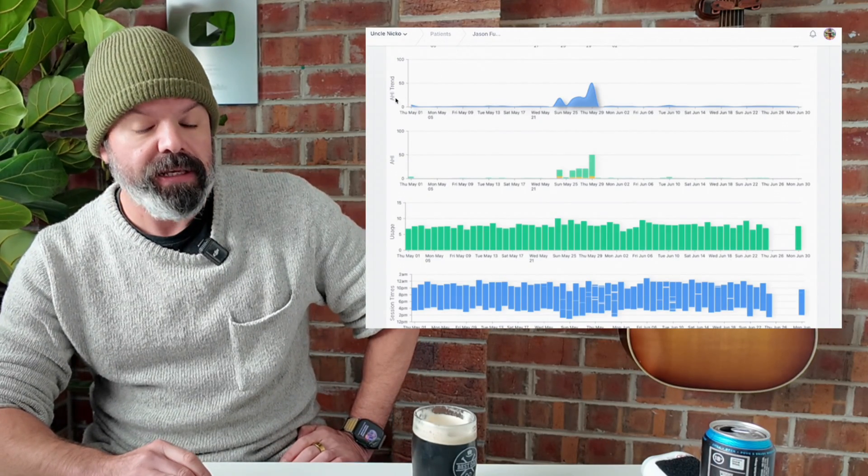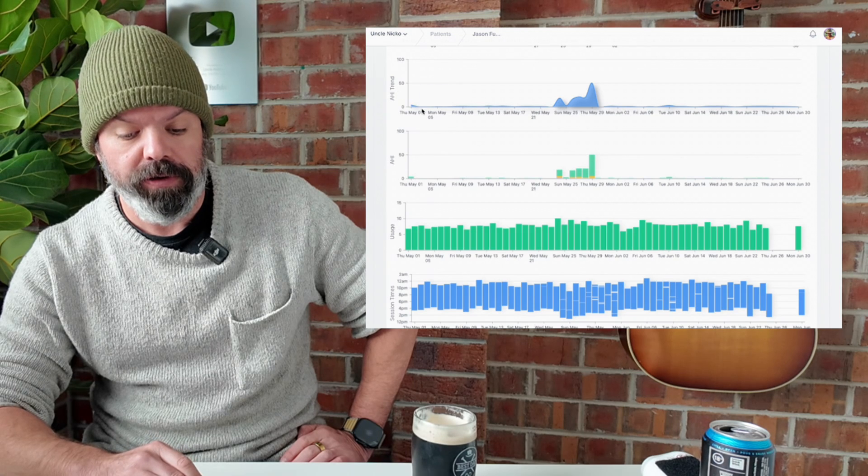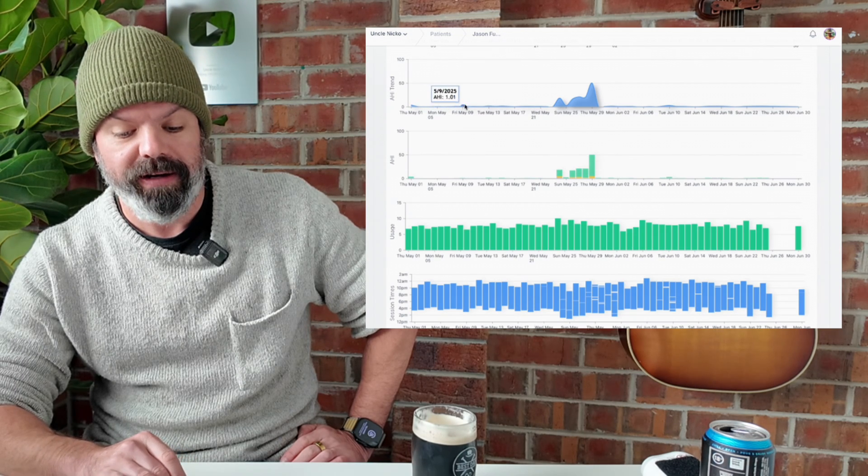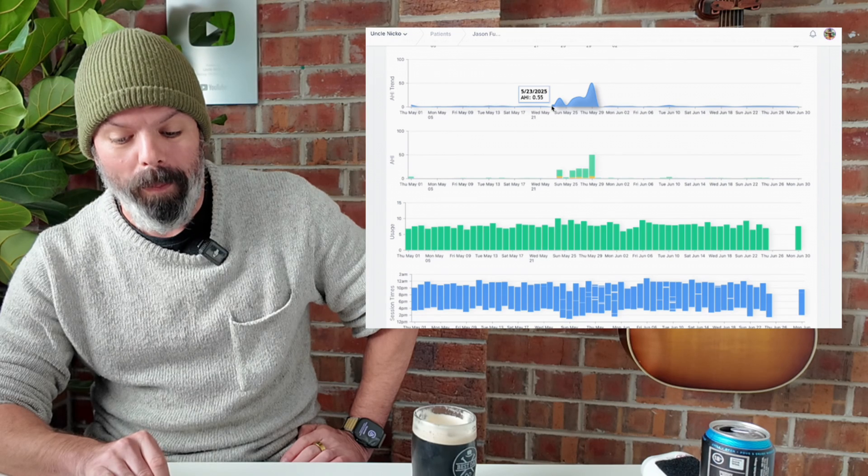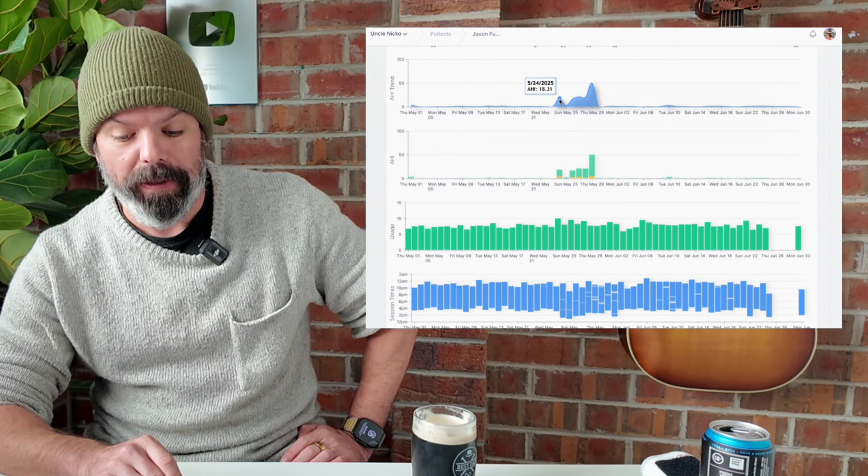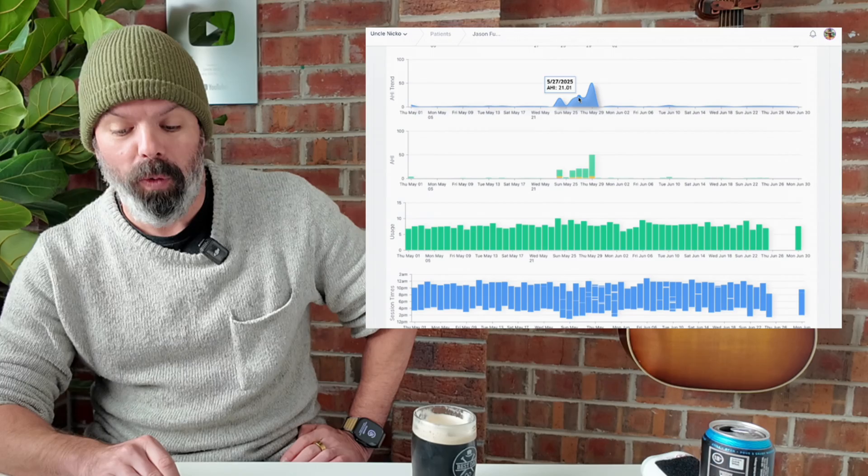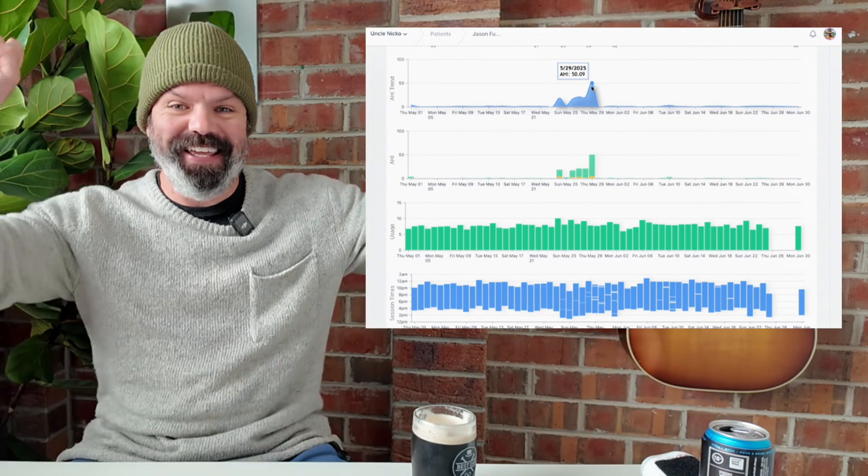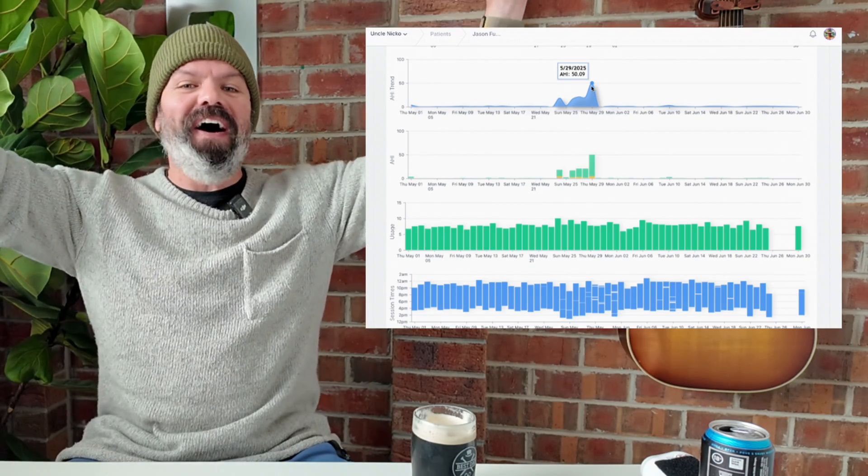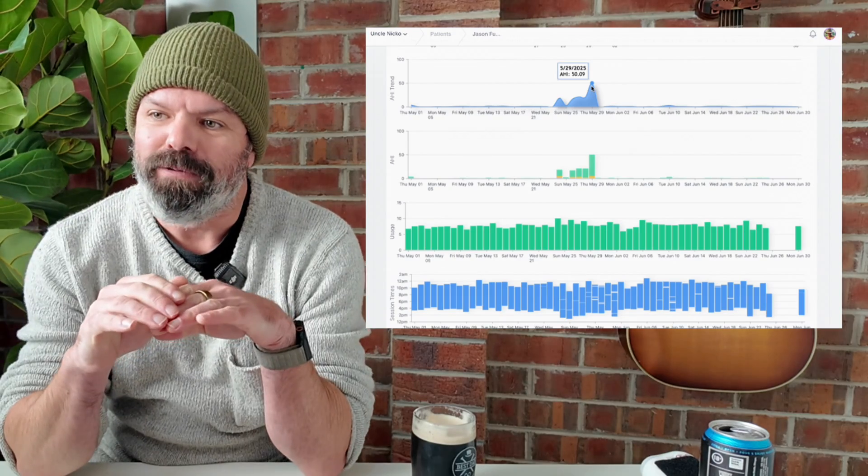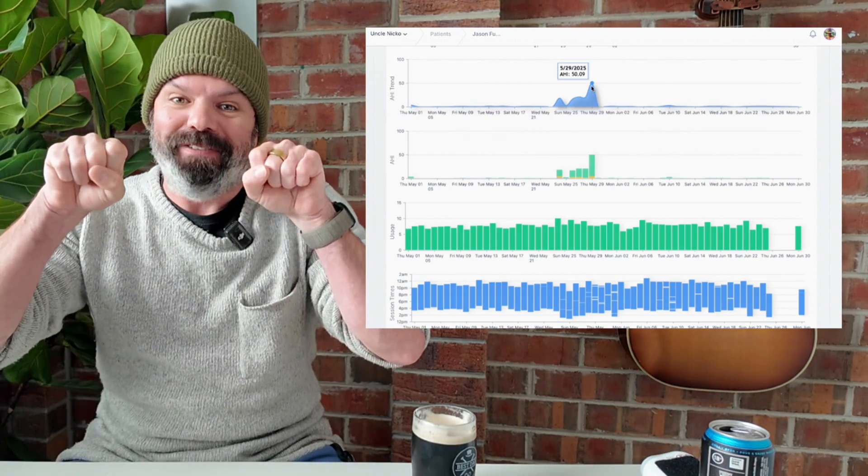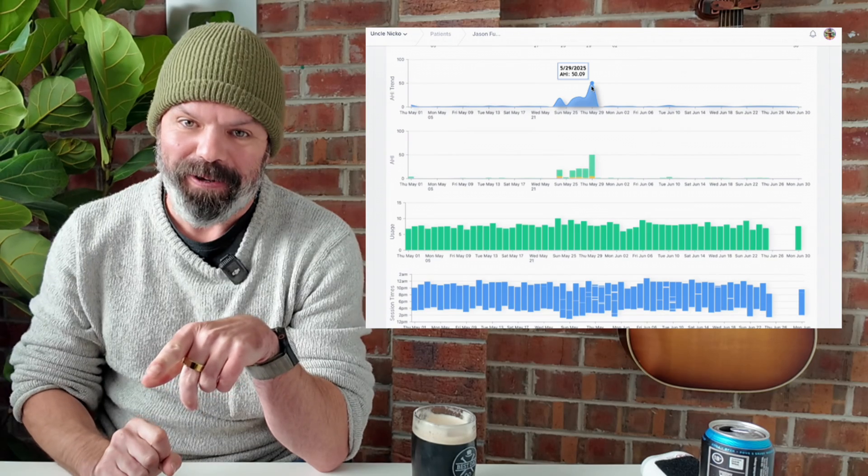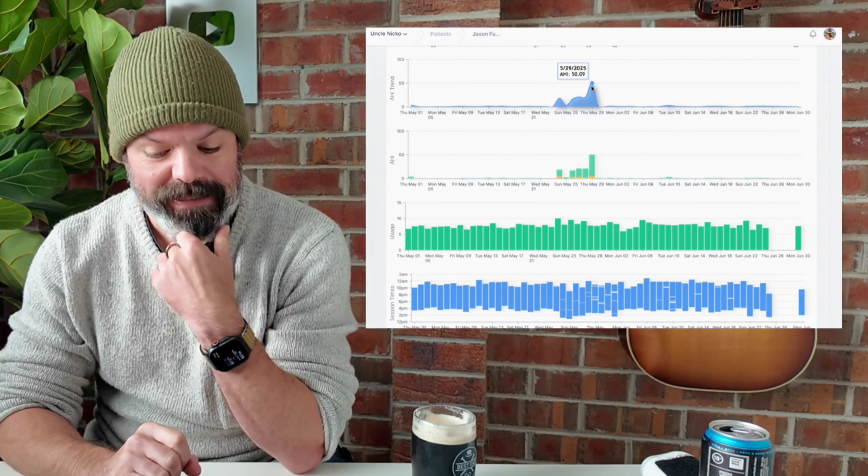Here's his AHI trend, cruising along here, less than one. And then out of nowhere, warp, 18.31, 21.01, 50.09. Now, your dog could take a great big bite out of his CPAP tube and it's probably not going to cause that spike in AHI.